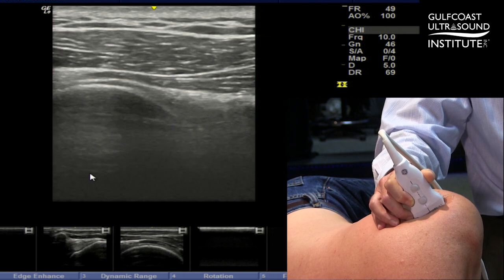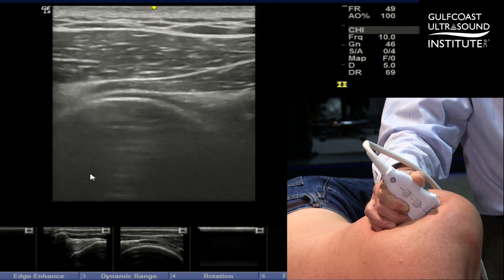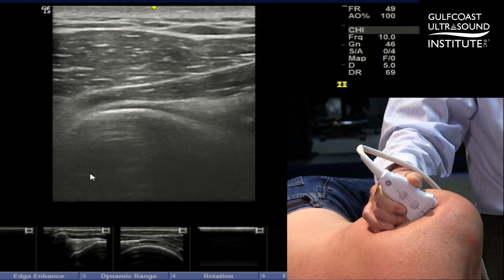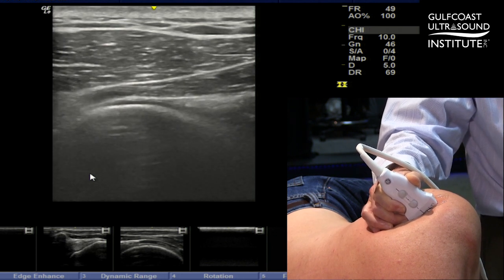So what we try to do is get that humeral head out of the way, and the way you can do that is just by tilting the humeral head down out of the way by putting pressure on the toe of the transducer. I'm really kind of pushing in on the more posterior part of that transducer. Let me demonstrate that again.